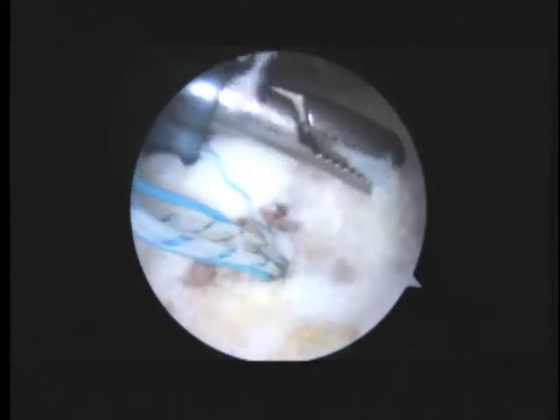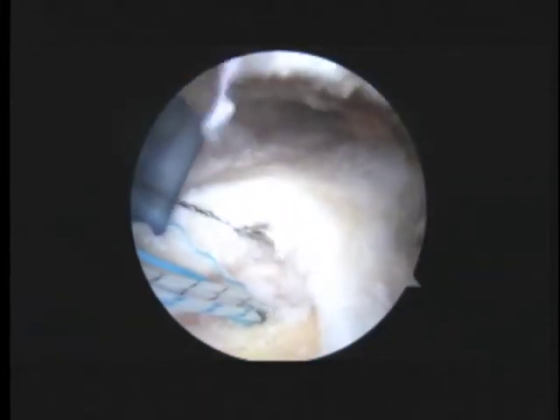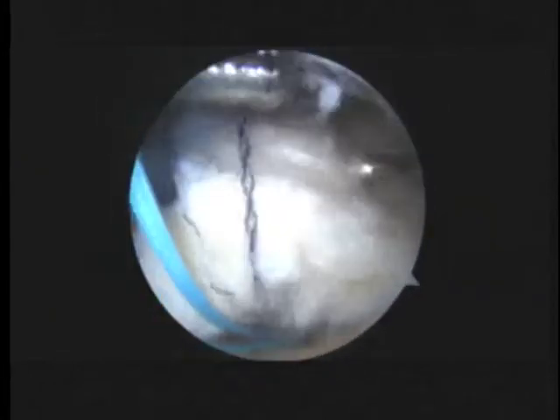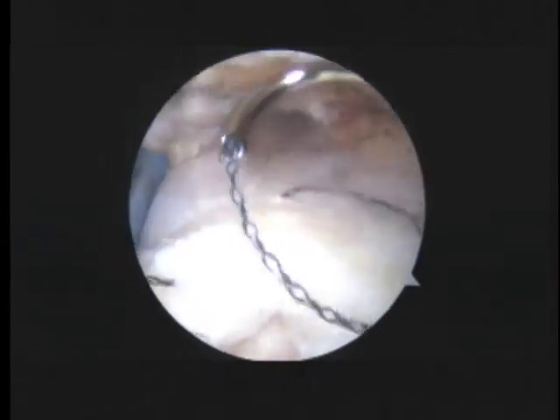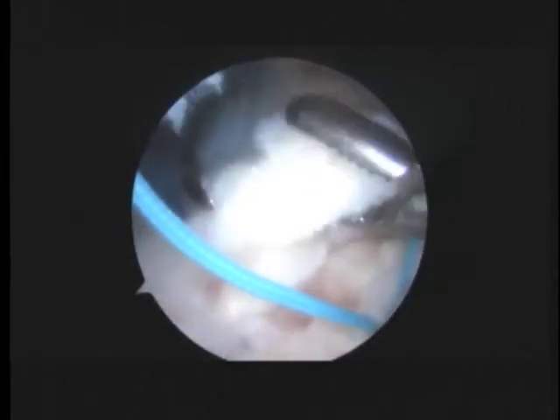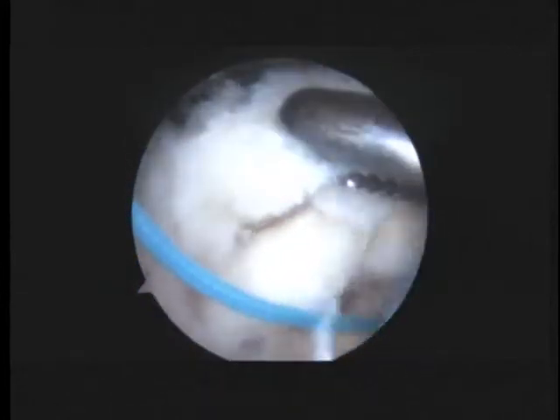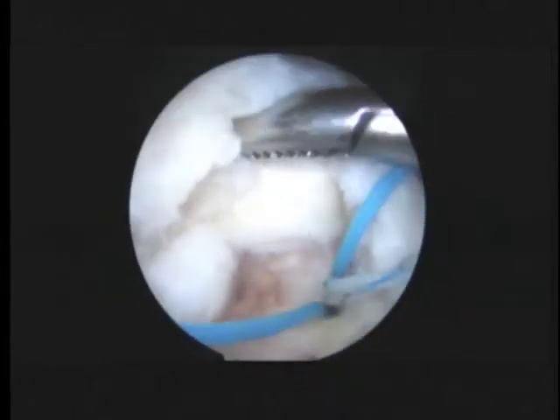And bring this through right there. Pause, please. Here's our second pass with the hook. Okay, pause please. Okay, and if this goes according to plan, this will be our final pass. Make sure we're not going through the biceps here. Sometimes we use the biceps as part of the repair. There we go. So we'll go ahead and feed that through.